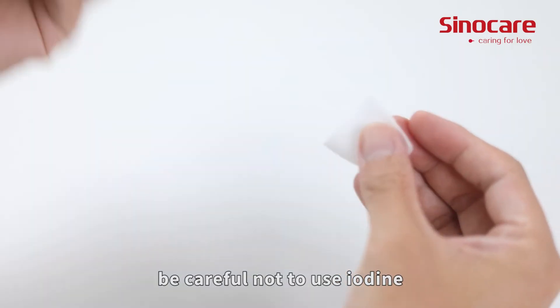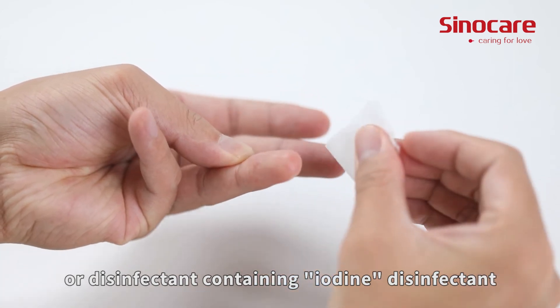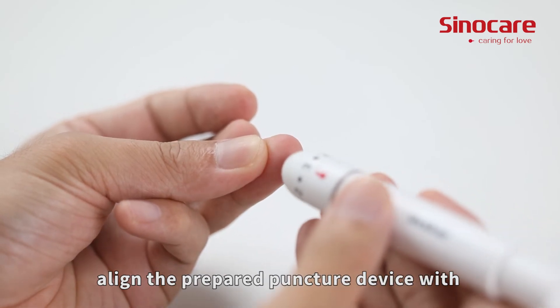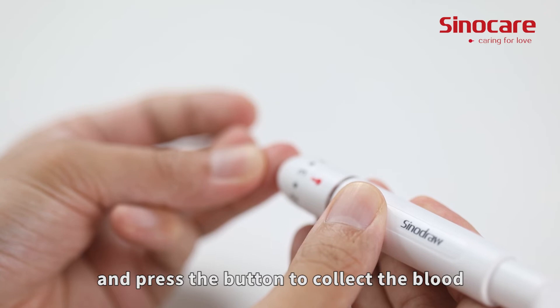Be careful not to use iodine or any disinfectant containing iodine. Once the alcohol has evaporated cleanly, align the prepared puncture device with the disinfected skin and press the button to collect the blood.